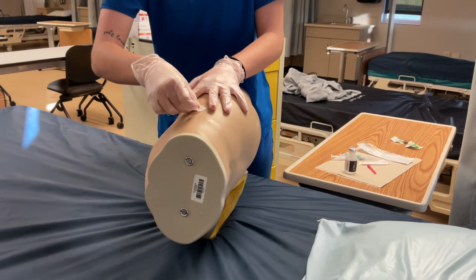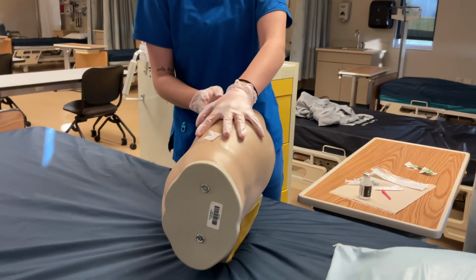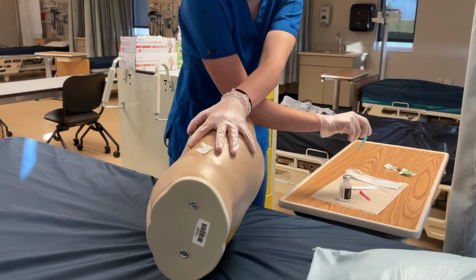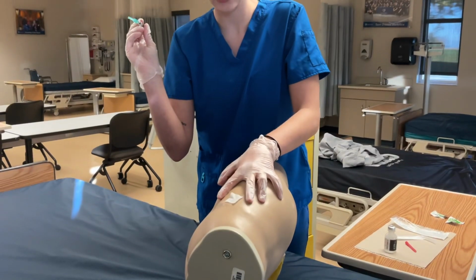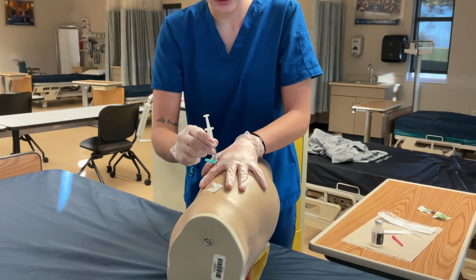And then I would place that right above so I know where I cleaned. I would let it dry for 30 seconds. Get my medication, pull that off one-handed, hold it like a dart. And then once it dries, I will insert it at a 90-degree angle.